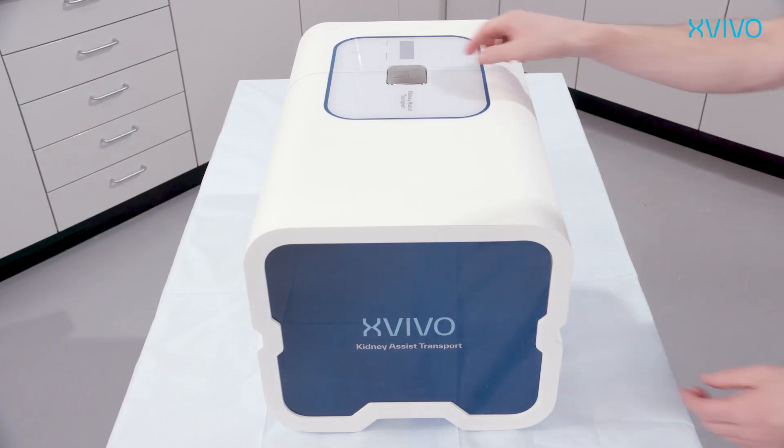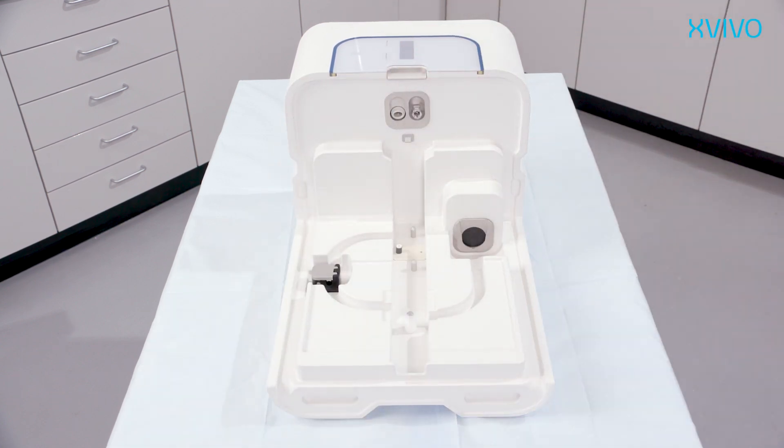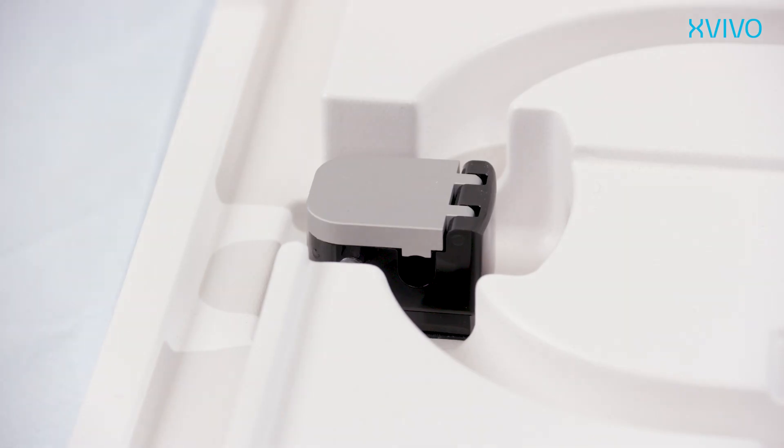When the cover is taken off you will enter the compartment where the disposable cartridge is placed in the machine. Here you will find the pump motor, connectors for the pressure sensor and oxygen line, and the flow sensor. This is the temperature sensor which automatically attaches to the reservoir in which the kidney is placed.